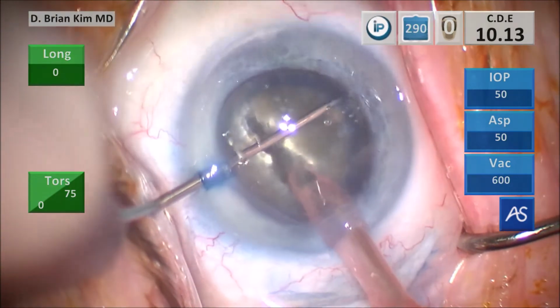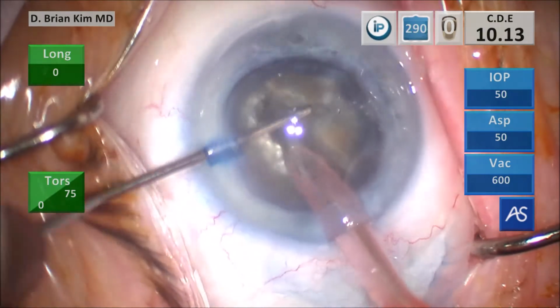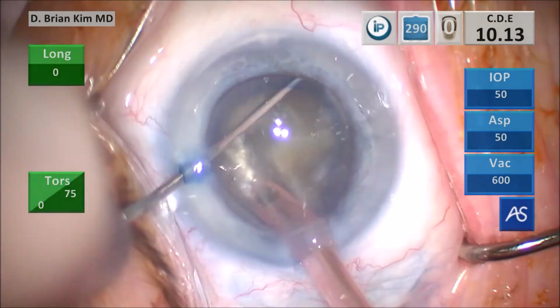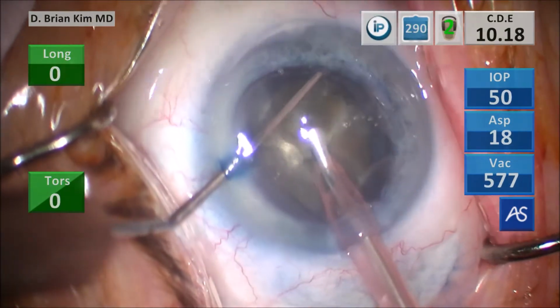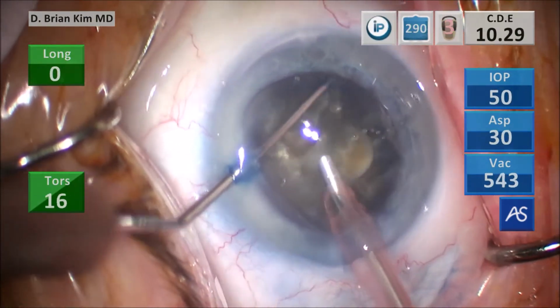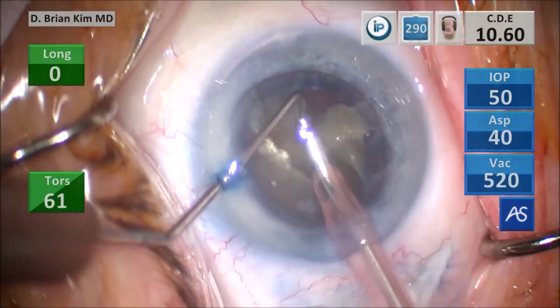Placing the chopper around the right heminucleus, hooking the peripheral lens, and keeping the phaco tip deep in the bag for a complete chop. Placing the chopper around that second quadrant and performing the same maneuver again with the phaco tip deep, and the phaco tip acts like a chopping block, grabbing that fragment up, crushing the lens between the instruments, and then emulsifying the lens piece.